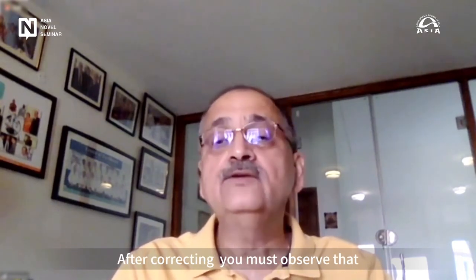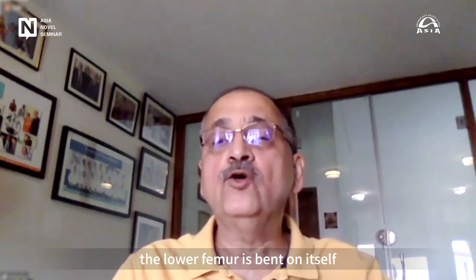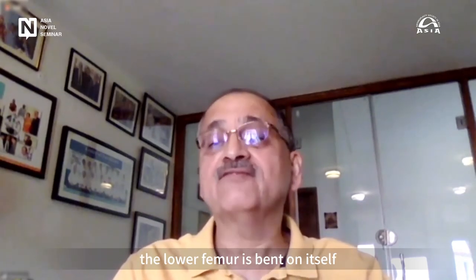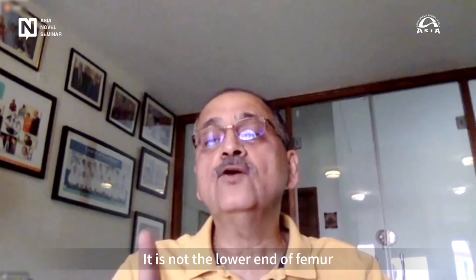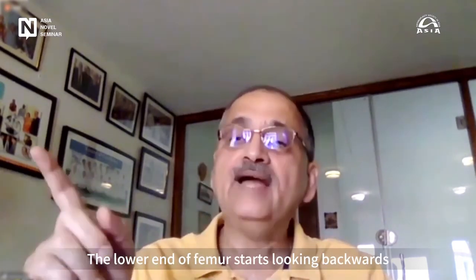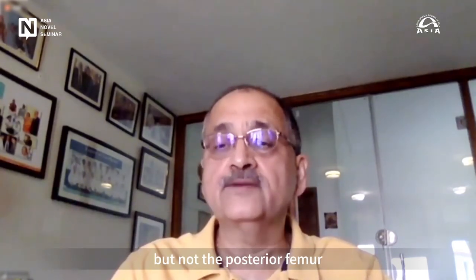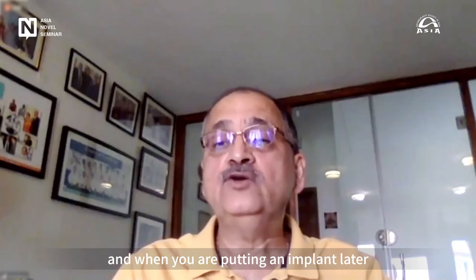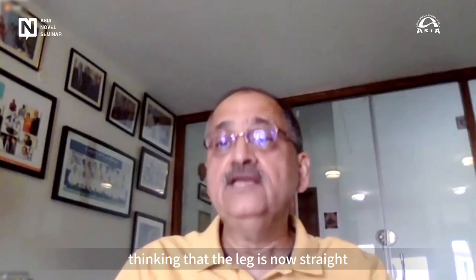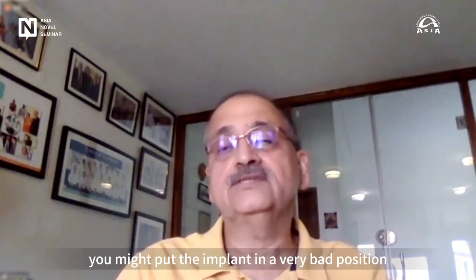After correcting, you must observe that in these developmental situations, because of the deformity, the lower femur is bent on itself. The lower end of the femur is not looking to the ground; it starts looking backwards. And that is the distal femur, not the posterior femur. So when you put an implant later, thinking that the leg is now straight, you might put the implant in a very bad position.